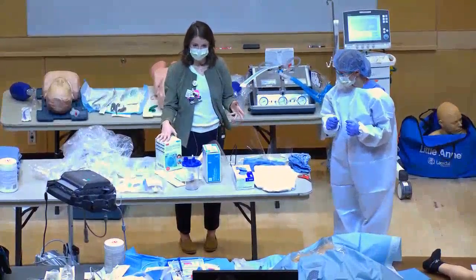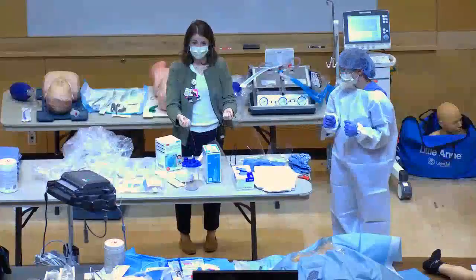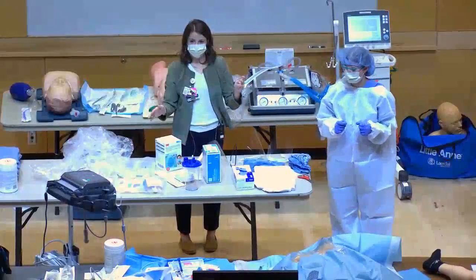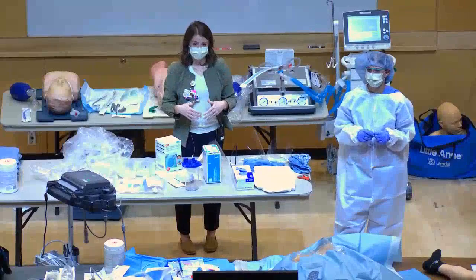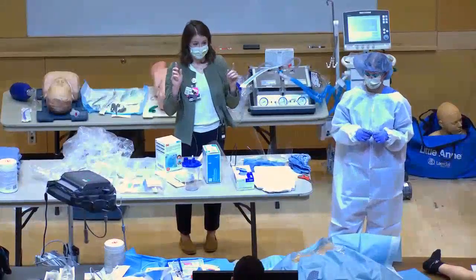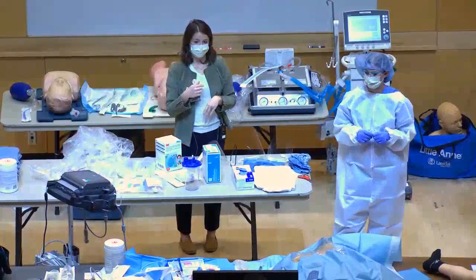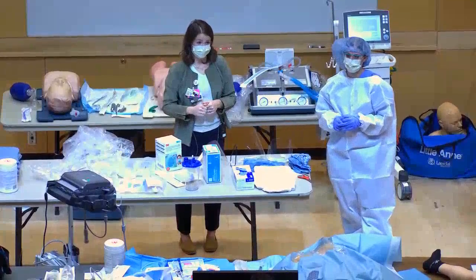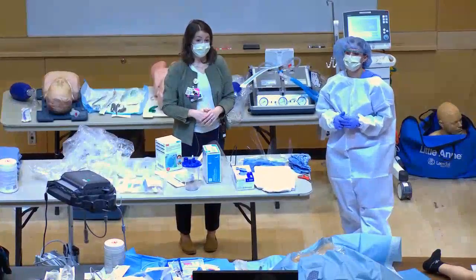Taking off PPE is more complicated because you've been touching the patient. You can remove the gown and gloves together — pull the gown from the top and wrap everything into a ball with your gloves. The CDC recommends washing your hands any time you contaminate them during doffing. The outside of the gown is considered contaminated. After removing the gown and gloves, wash hands, then remove goggles, wash hands again, exit the room, and remove your mask outside.